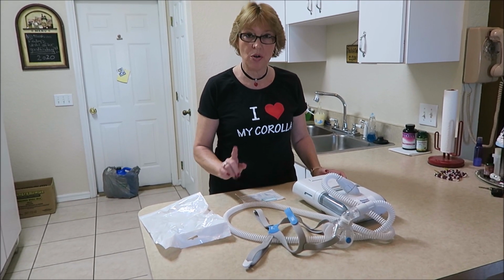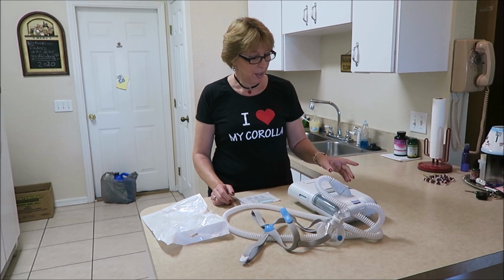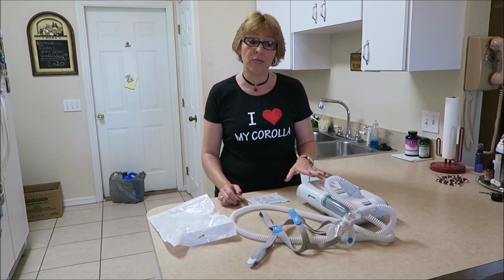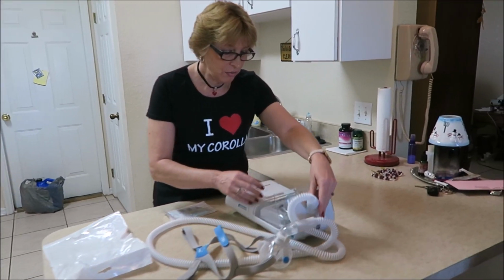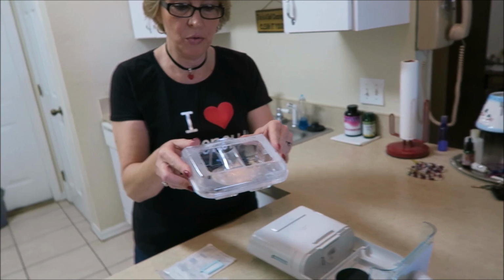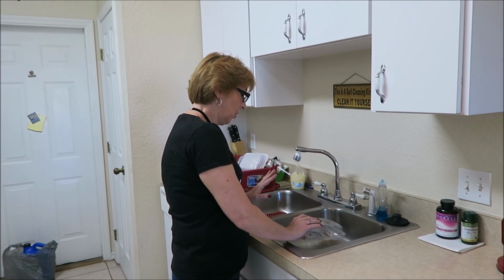I told you I was going to do a video on how you clean the machine or the hose and change everything out for this particular mask. So here we go. We're going to take this out. Whatever water is left over, just dump it out.